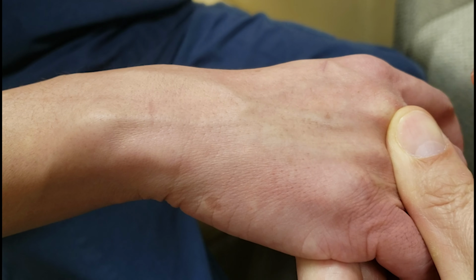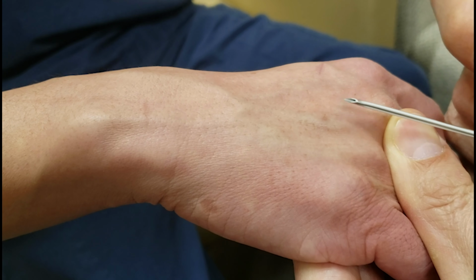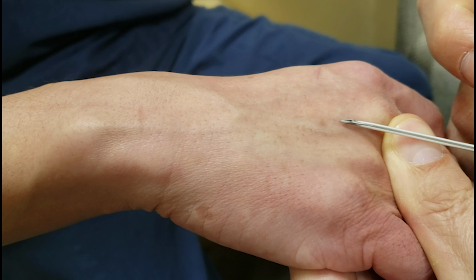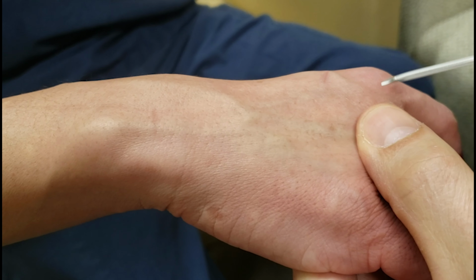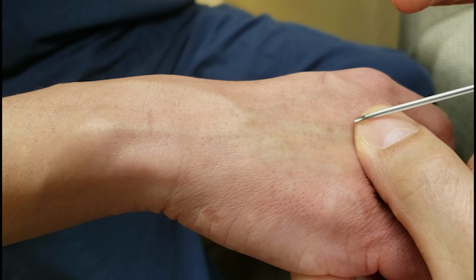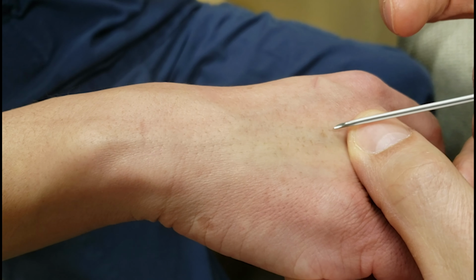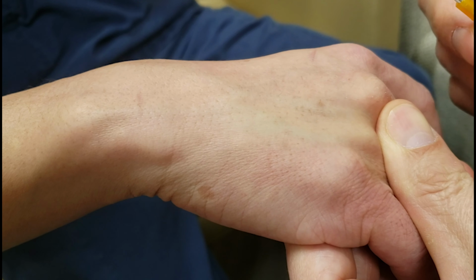Notice where my finger is. My finger is out of plane. Why is that? My finger's out of plane because I want to be able to put the IV in completely parallel to the vein. All too often what people do is they'll have their thumb here and come down at an angle like this. When they try to get the whole bevel in, they're going to go through and through the vein and miss it. So again, the thumb is out of plane.